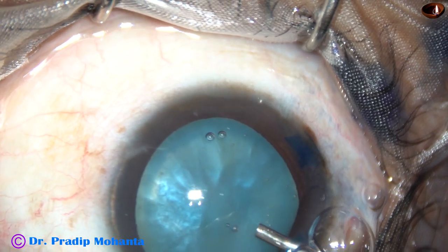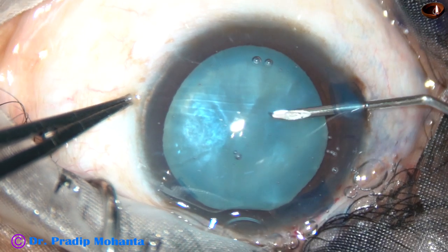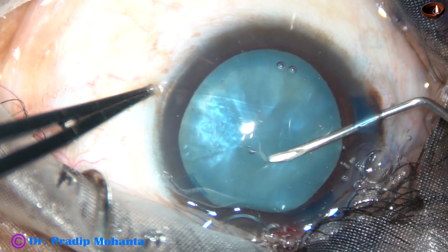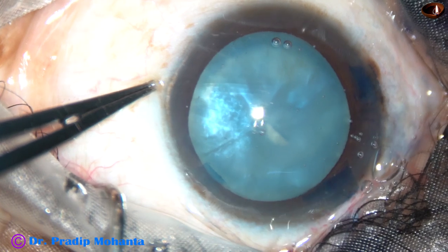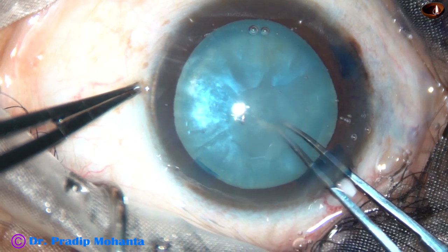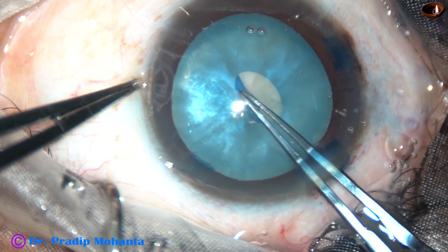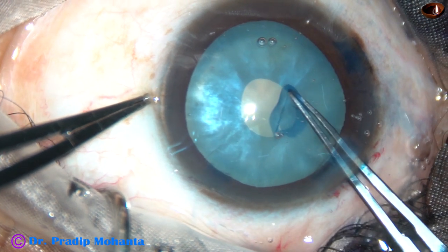This is an intumescent cataract. 2% HPMC is injected into the anterior chamber and the anterior capsule is incised and a C-flap is raised. I use a Utrata forceps, hold this C-flap and convert it into a small rhexis. I call it a mini rhexis.